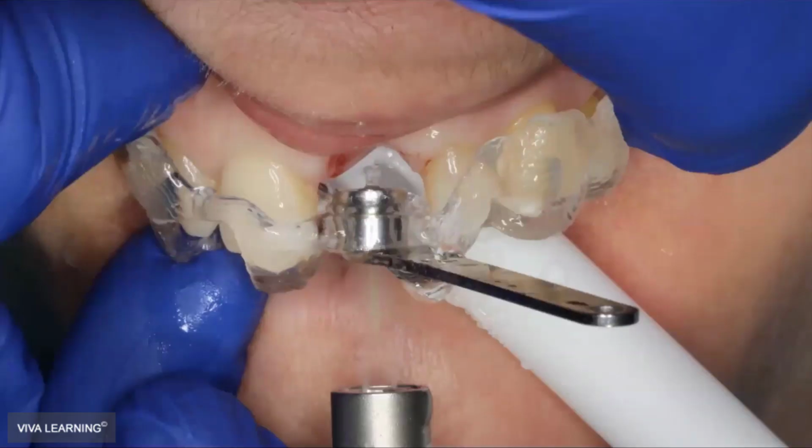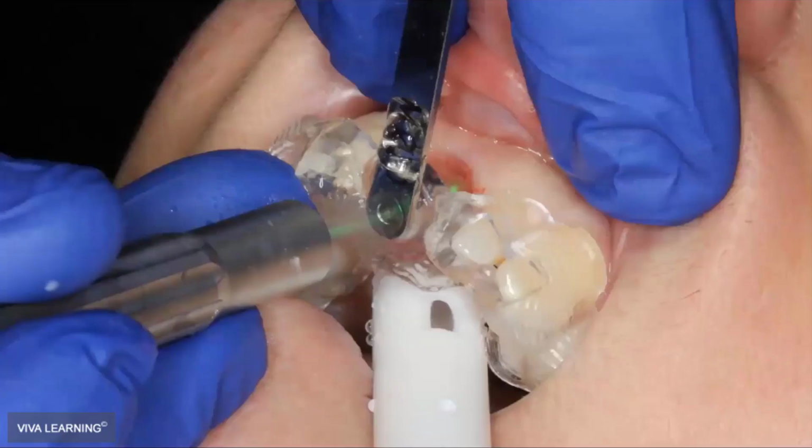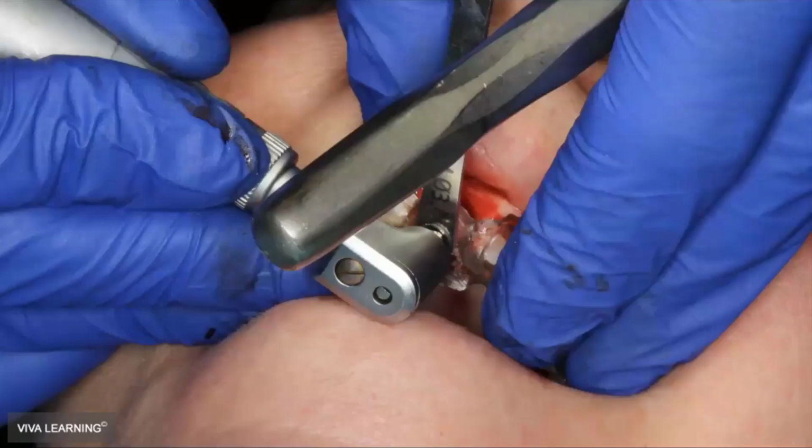This is where a pilot laser technique comes into play again. We don't necessarily have a socket wall that we're dealing with, but we're shooting it through the guide, just a photo of what that looks like. It's a better photo of what that looks like because you can see the laser coming out on the other side and interacting with the soft tissue.